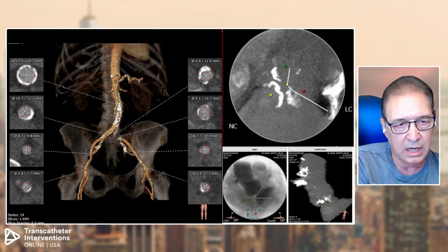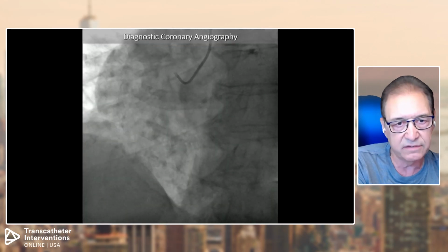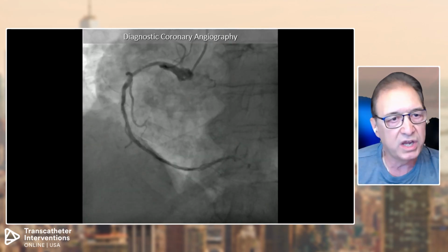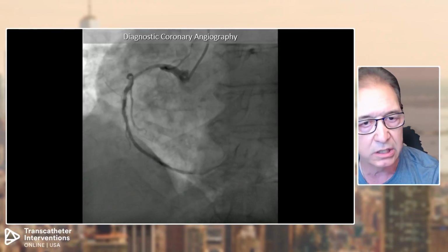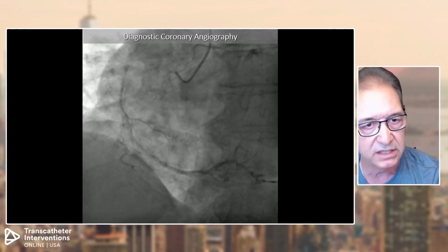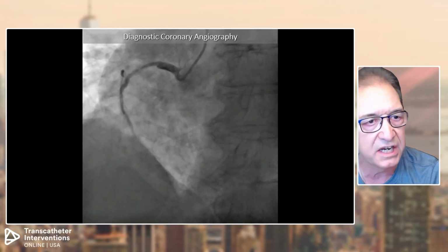Here are her peripheral vessels, and this comes into play when you see the sum total of what this case involved. So we took her to the cardiac catheterization laboratory in anticipation of valve therapy, catheter-based valve therapy because of her age and overall frailty.